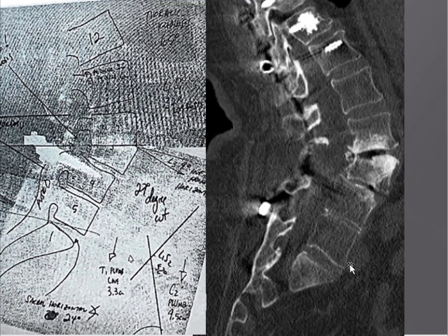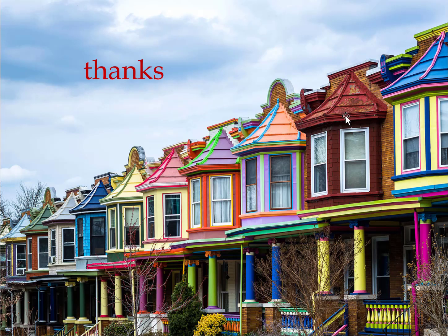Again, the iliac screws, and just the before and after, here's the plan that I had on the left and the after CAT scan, just comparing it. I think the spondylolisthesis reduced fairly nicely at the level of pedicle subtraction osteotomy, and there's excellent correction.